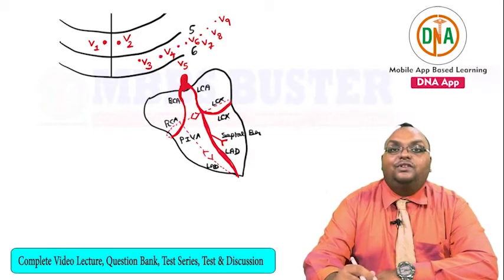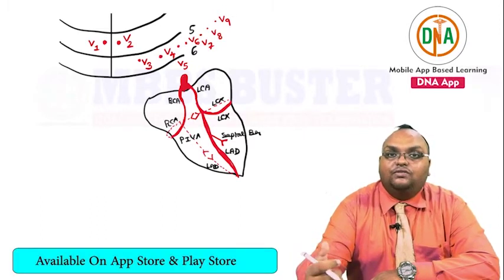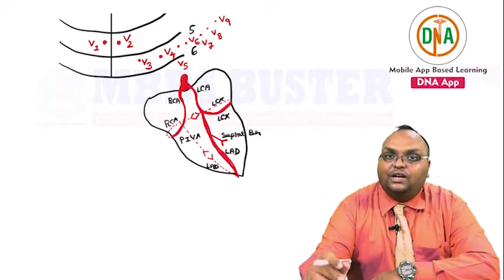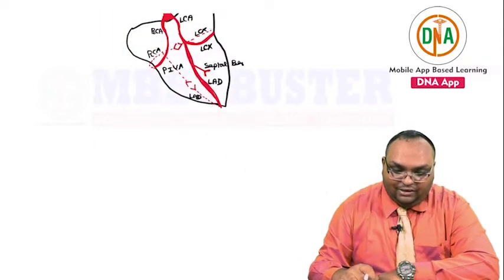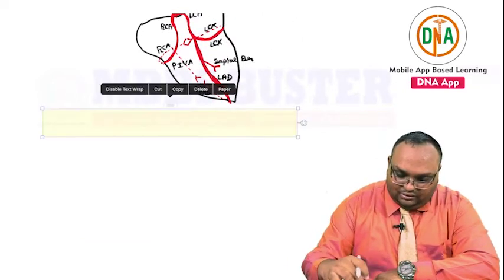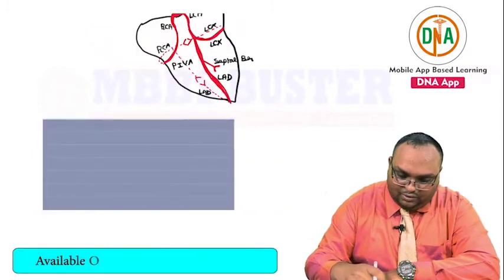The different leads that we studied about look at some specific regions of the heart. Somebody looks at the anterior surface, somebody looks at the lateral surface, somebody looks at the posterior surface, right? So we need to have an idea about which leads look at which surface of the heart. So primarily, if we want to divide, we could divide this entire concept which I am trying to explain to you into some subparts.